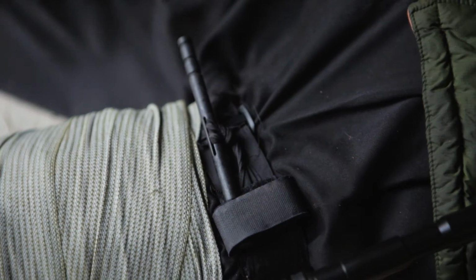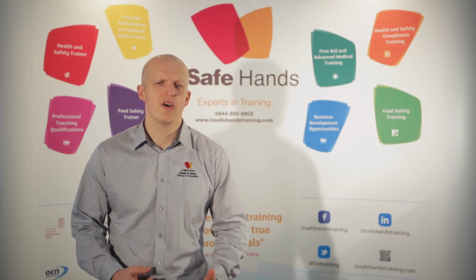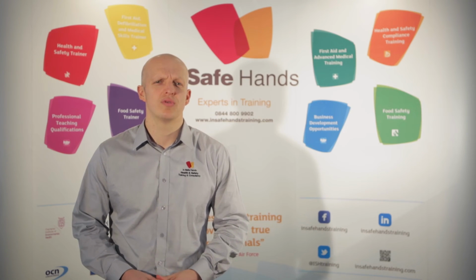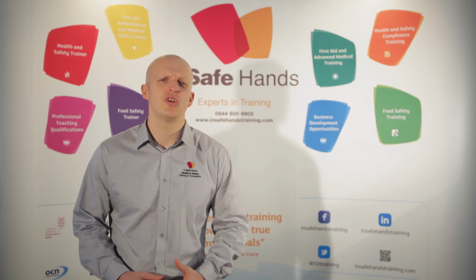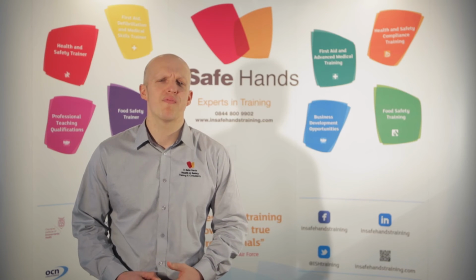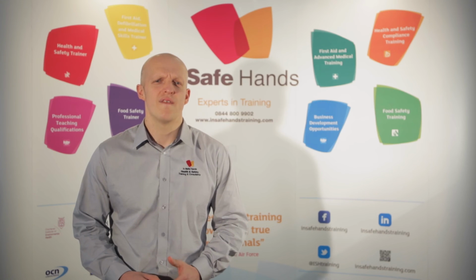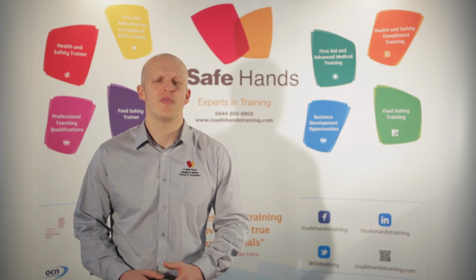Once you've moved through your primary survey and we get to the reassessment phase, it's absolutely vital that we look at the wound sites. If the wounds are still bleeding, then we may need to put more pressure on an existing tourniquet or consider putting a further tourniquet 5 centimetres above the first.